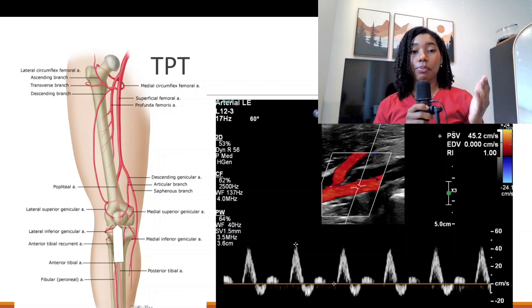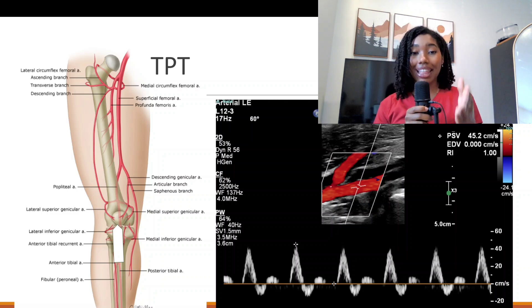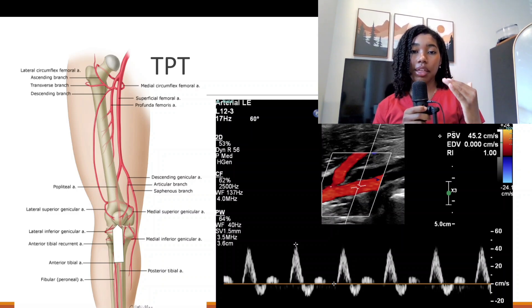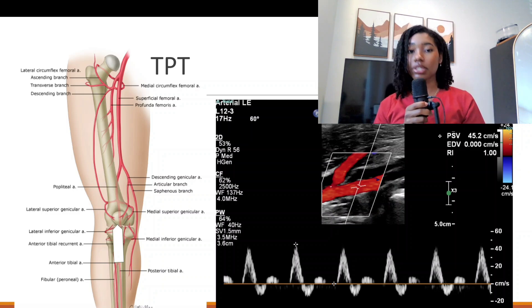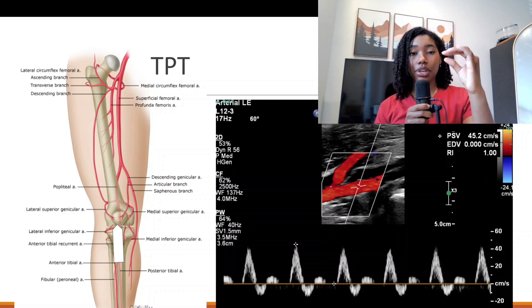Whenever you come across stenosis, take images proximal to the stenosis, at the stenosis, and distal to the stenosis. That way you can grade the stenosis by comparing velocities proximal to and at the stenosis using a ratio — how many times higher the blood flow is at the stenosis versus proximal to it. Accurate velocity measurements are absolutely necessary; if there is a narrowing, you want to obtain the highest possible velocity at the narrowing.